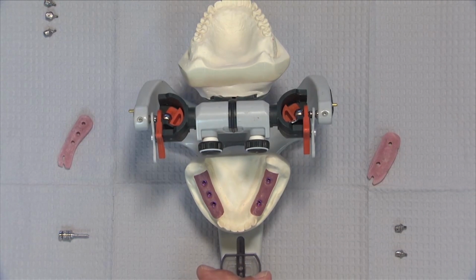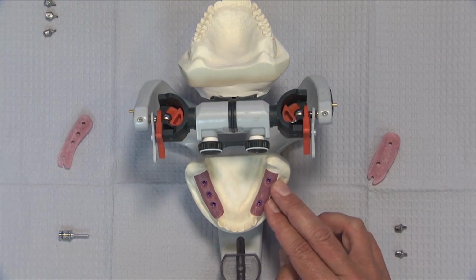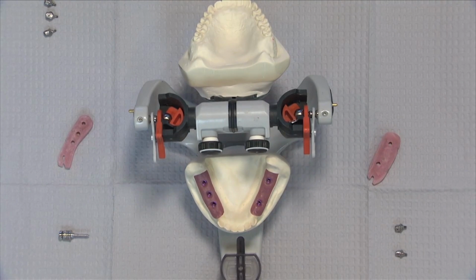And in a case like this, I'm a big fan of custom abutments, especially on, say, this side here where we're doing a bridge. I just don't think there's any way to beat custom abutments when we're going to have a bridge in terms of draw, in terms of support structure for the bridge itself. I think this is just a great use for custom abutments. So the laboratory has now sent us back a couple of custom abutments along with our positioning bite index. So let's take a look at how we're going to use this.